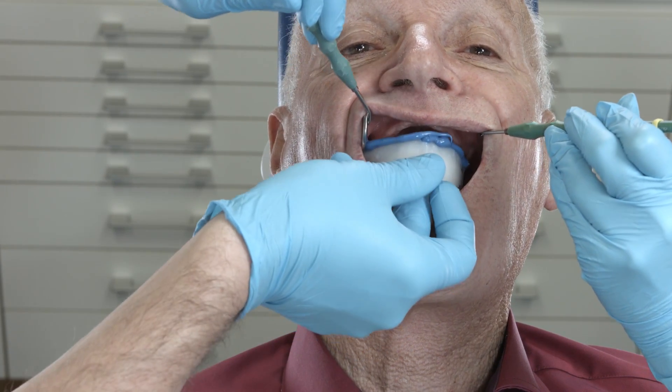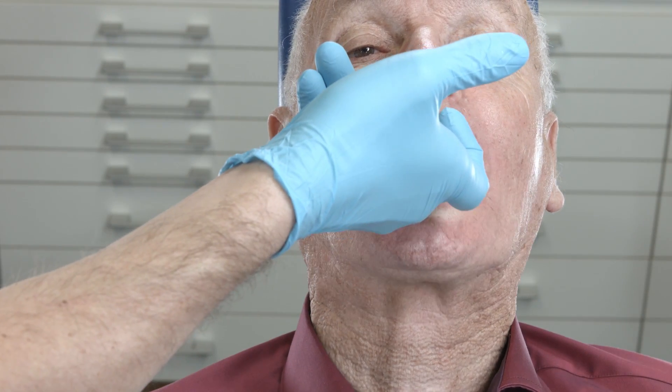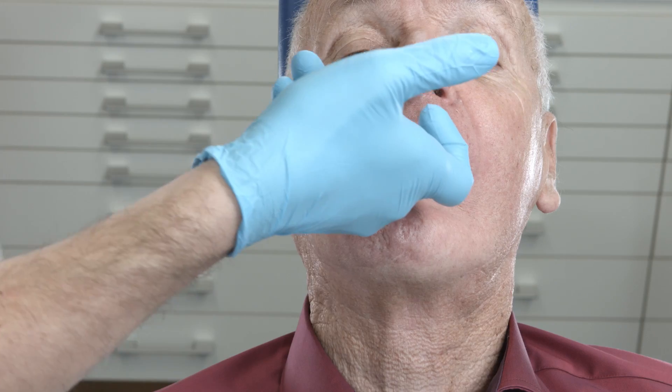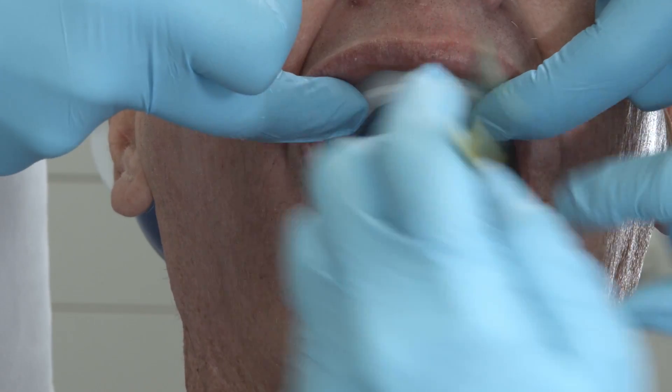Ask the patient to suck on your finger once or twice, and then to move the lower jaw to the right and to the left. This activates the muscles. Next, insert the tray in the lower jaw.